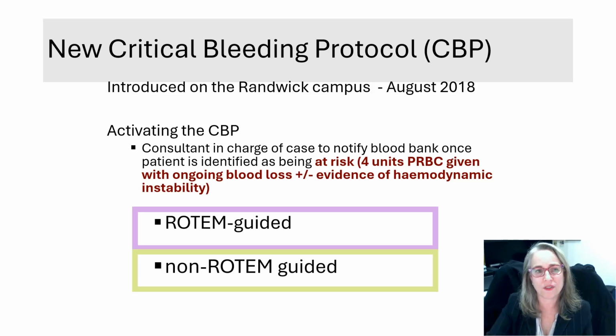So after a couple of years of getting it to work and moving it across the campus, we then had to embed it into what was a massive transfusion protocol. And at that time, our haematologist decided to call it the critical bleeding protocol. So we have this, which is called the critical bleeding protocol. It was brought in 2018 as a collaborative effort with the Rotem working party, working within the transfusion committee.